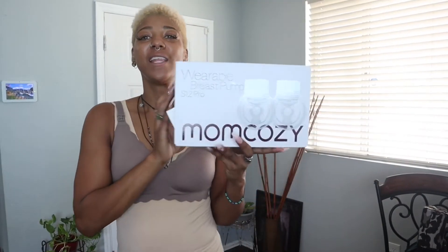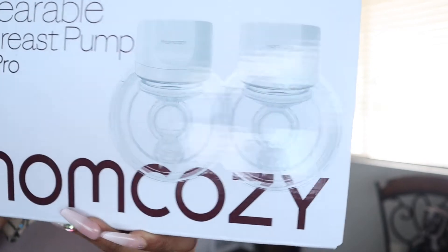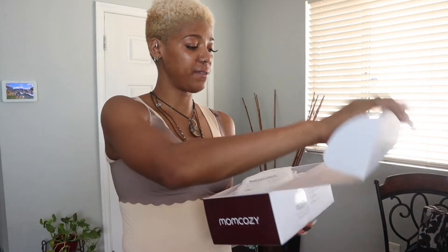Hi guys, thanks for joining me. My name is Shana J Rae. This is the Mom Cozy S12 Pro Wearable Breast Pump. These are great for any nursing, breastfeeding mom.